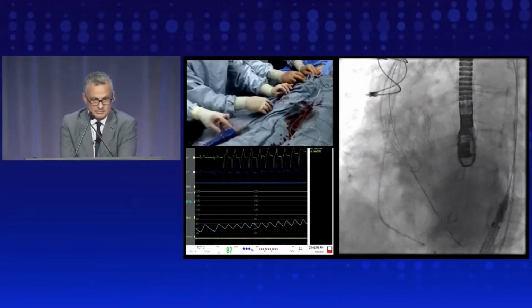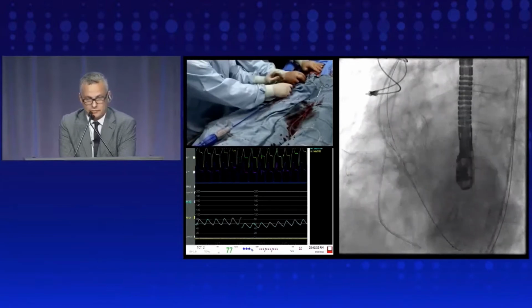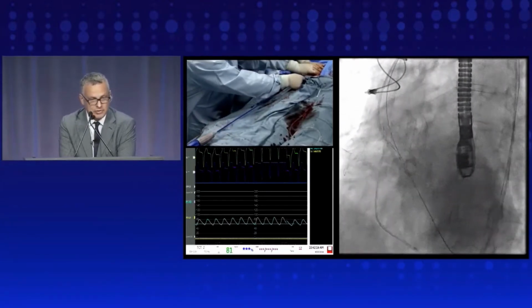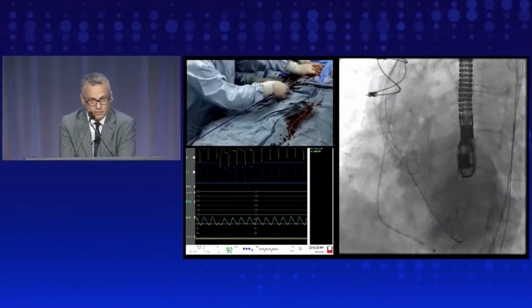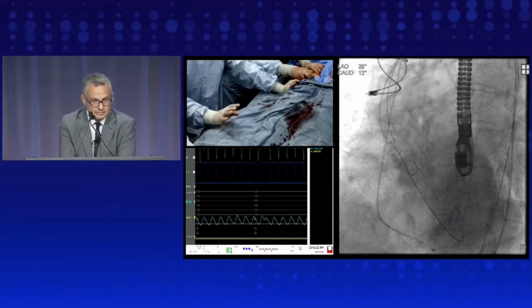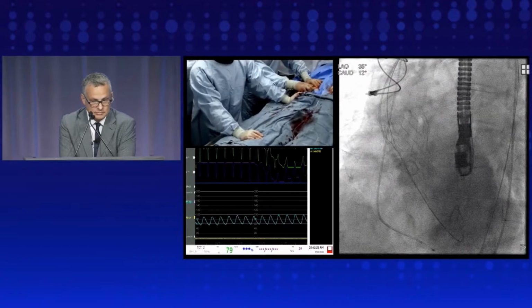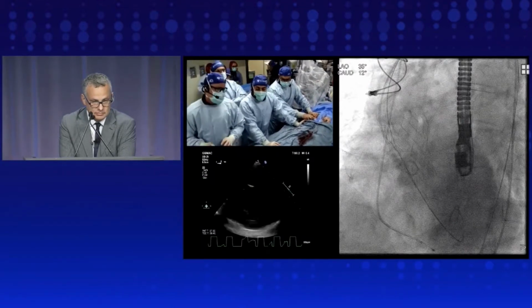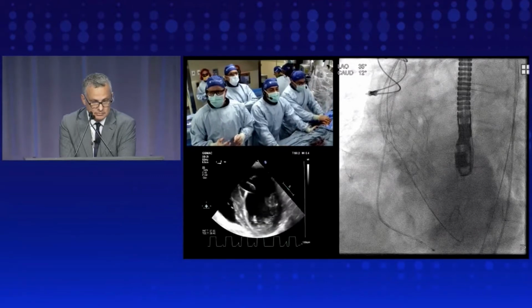Okay. Let's keep the wire and bring a pigtail inside. So first of all, we can already see the difference in the diastolic pressure. Very good. Very promising. The first question that we have in these cases is whether we have coronary obstruction. So maybe we'll ask to see if the LV changed. Is there any quick change now in the flow? We can see also the flow to the coronaries.